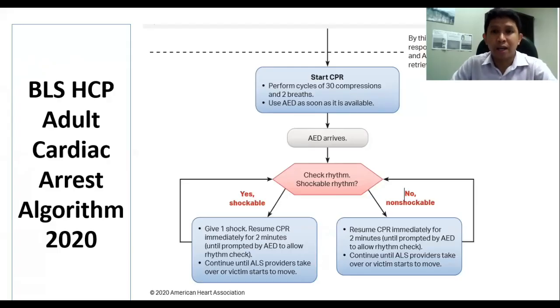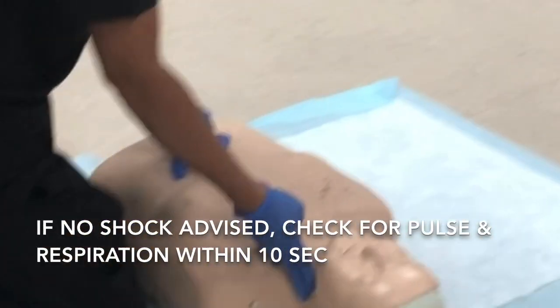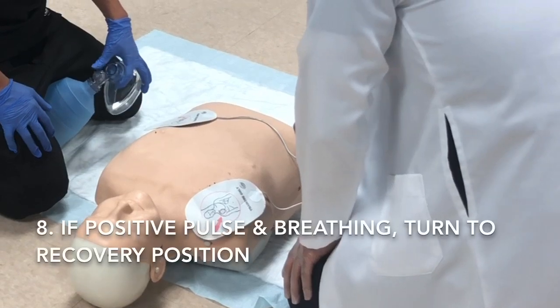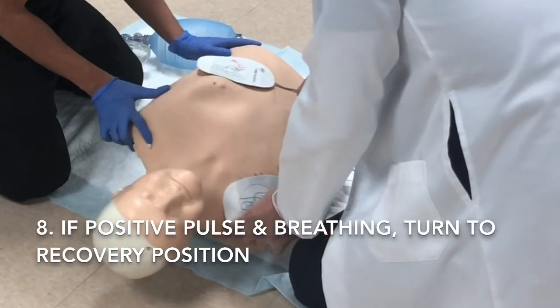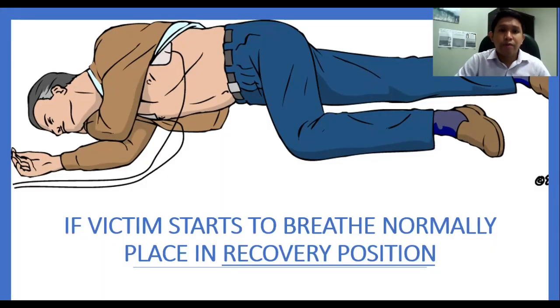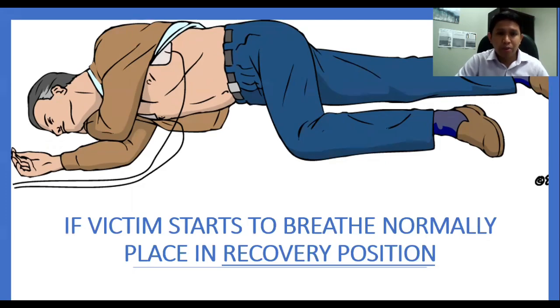If no shock is advised, again you need to assess the pulse and breathing and act accordingly. If the victim starts to breathe normally, place the patient in the recovery position.